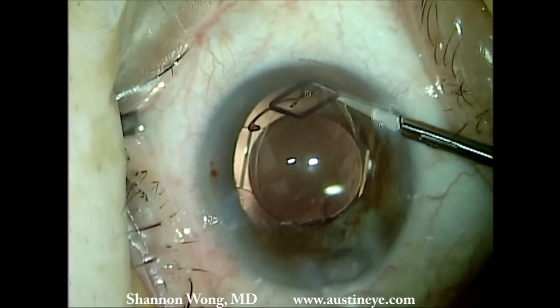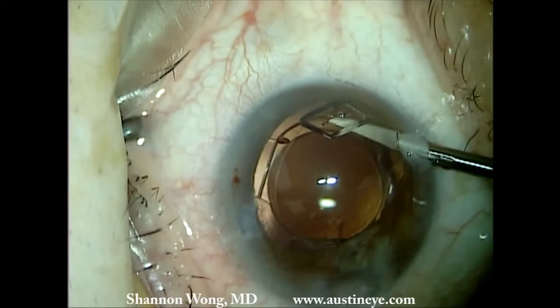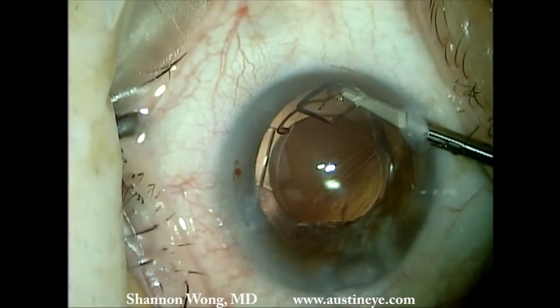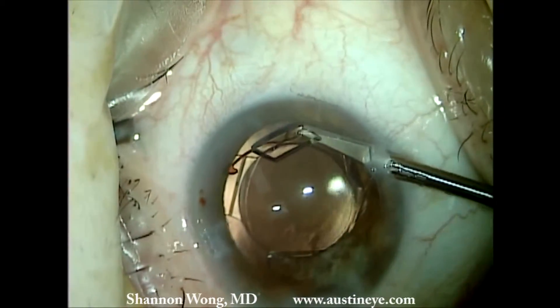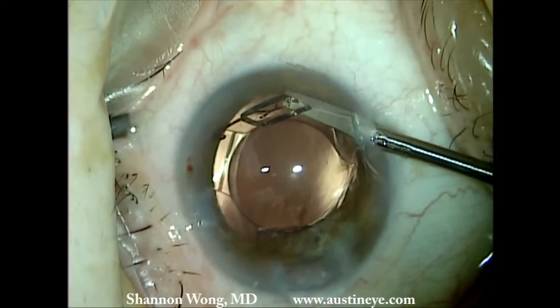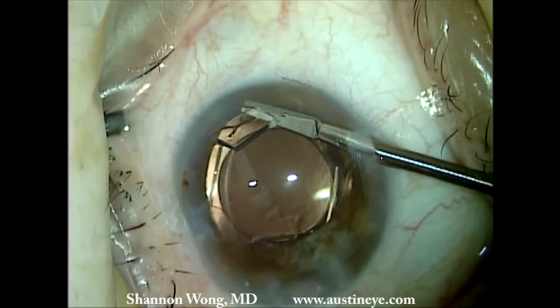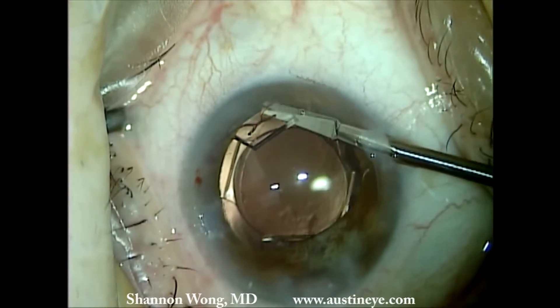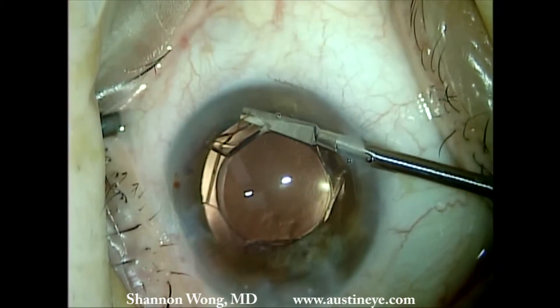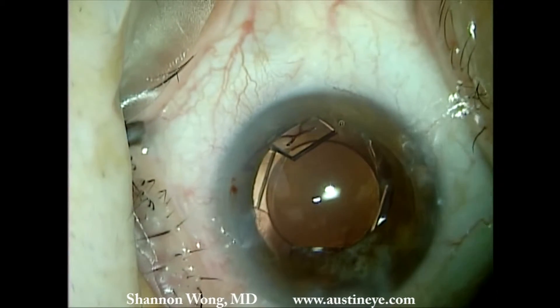Once the lens has been positioned, we find that one of the haptics is now subluxing into the anterior chamber, so we amputate this haptic but leave the fibrosed segment in the capsular bag.